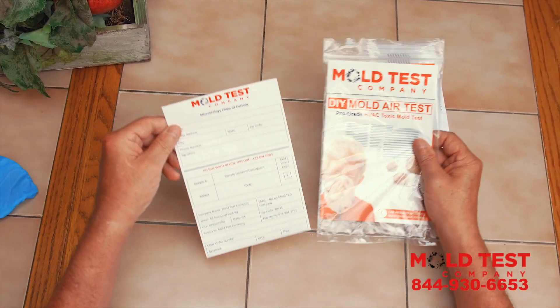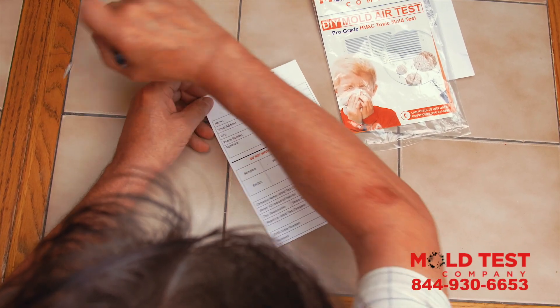Step 5. Fill the top portion of the microbiology chain of custody sheet.